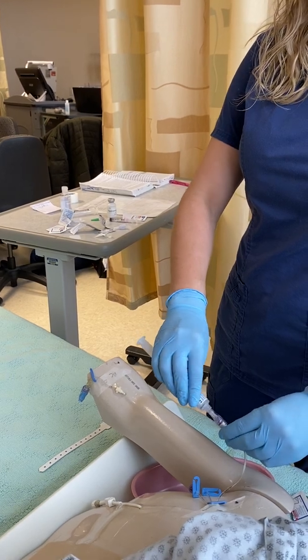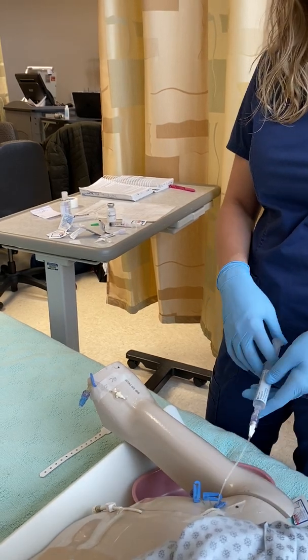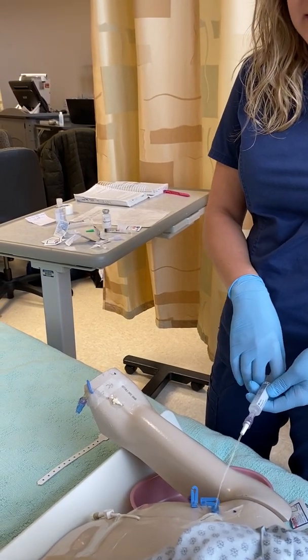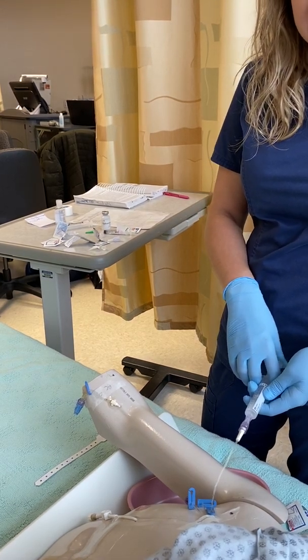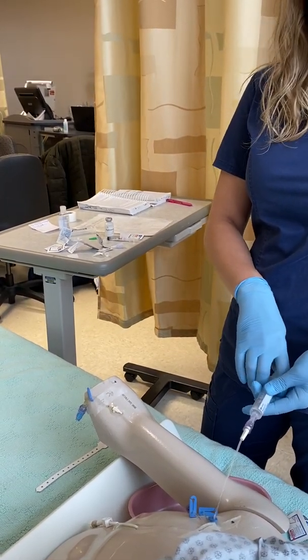Flushing for the same amount of time as you gave your medication, because there's still meds in the line and the point is to flush it out so they get the full dose. So per facility policy, you flush with however much they say. In this case, we're going to say 10, giving that over the 2 to 3 minutes. Still monitoring for adverse reactions.